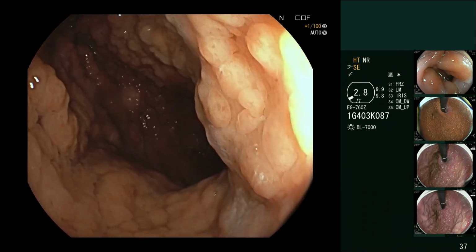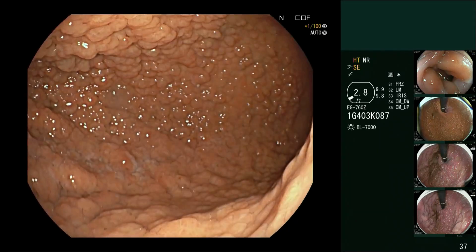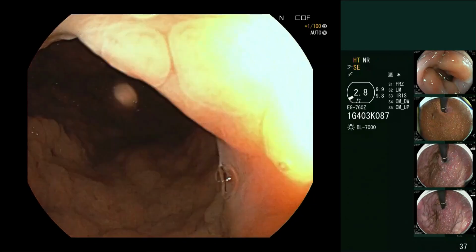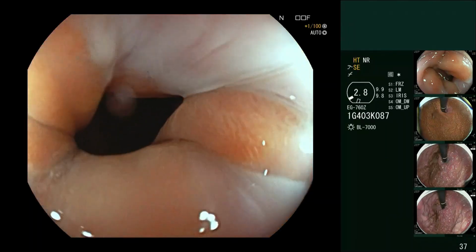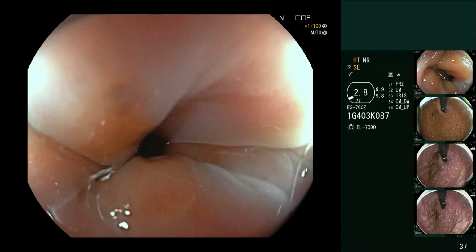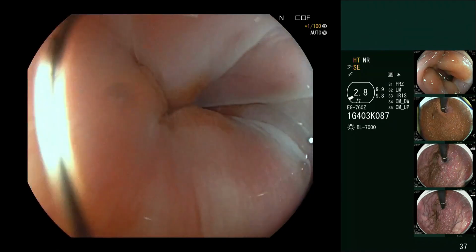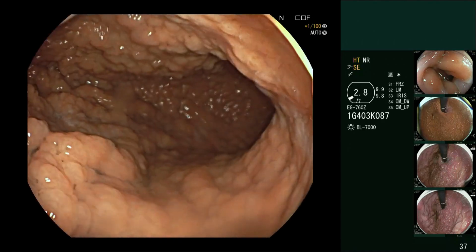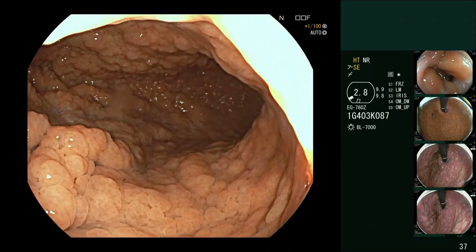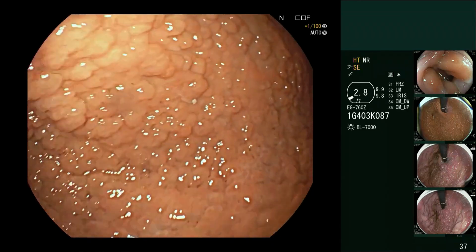We get the stomach in a neutral position. It's quite important to know where the neutral position is, which is like this. Lesser curve at 3, greater curve at 9, come back to the junction. We're not focusing on the esophagus, but the gastroesophageal junction is quite an important place to image, and imaging it without a cap is quite difficult, as is demonstrated here. But imaging the stomach without a cap is quite useful because you get a wider field of view.